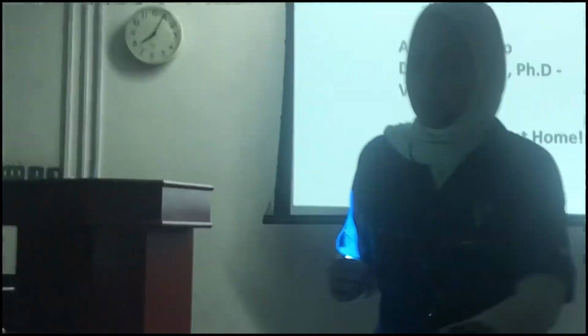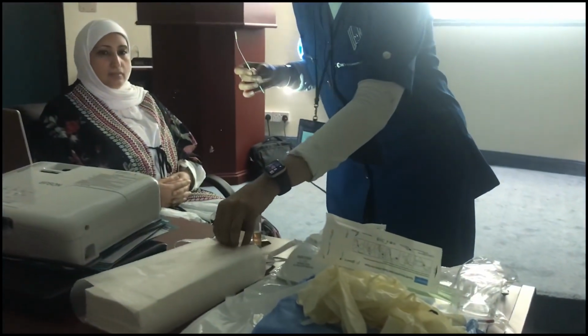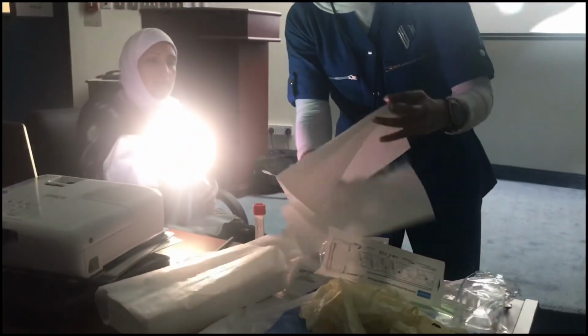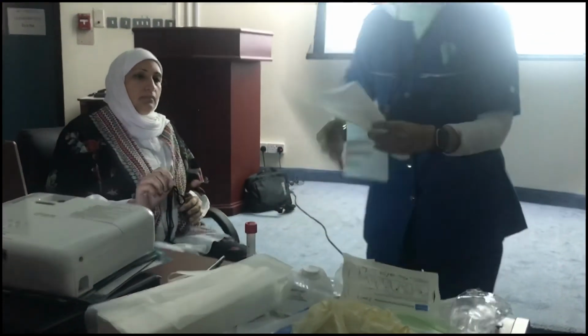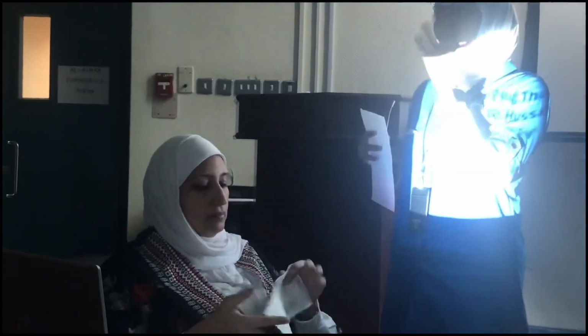First thing, you have to take a cotton sheet and put it on the patient. So if anything sprays or anything, it will not contaminate the clothes. Then you should not stand in front of the patient in any situation, because if he sneezes or anything, it will be on you. So always be on the side of the patient and ask him to sneeze. Can you please sneeze and clear your nose?